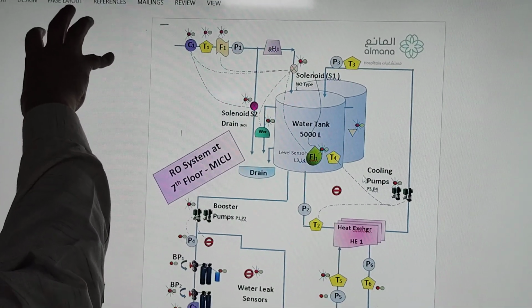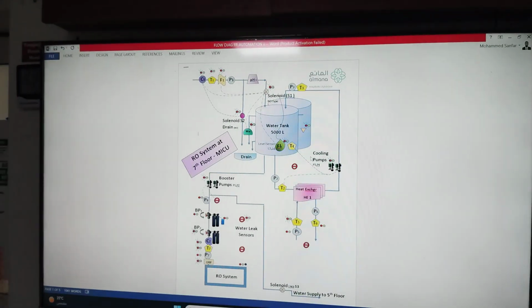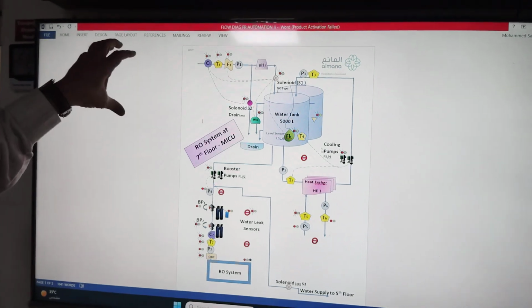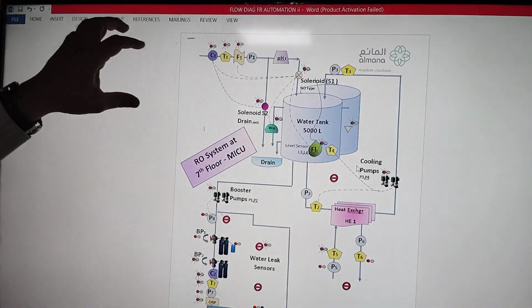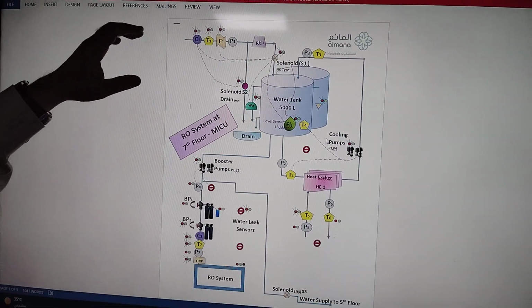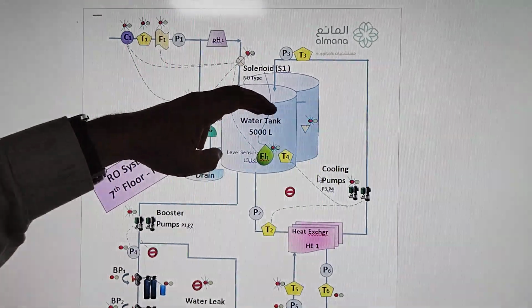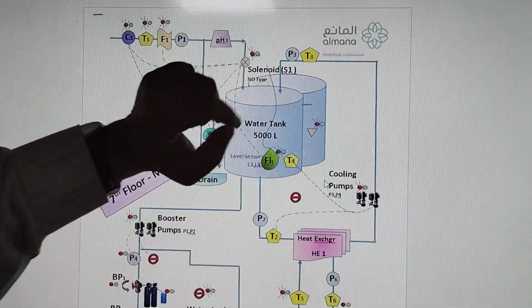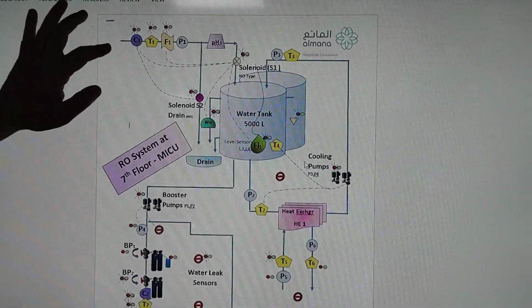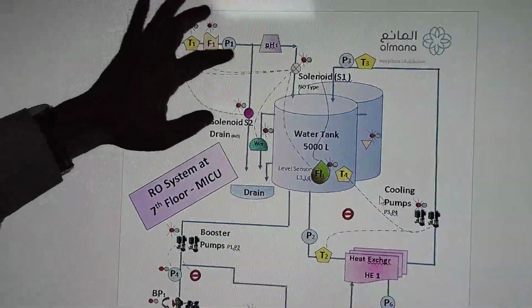They prepare the water to a quality of up to 200 microsiemens maximum, and then it is stored in two tanks, 5,000 liters each. Once it is filled up and ready, it will be fed into our feed water tanks. We have two 2,000 liter tanks over here. Once the water comes in, before it comes into the tank, it has to pass through all these sensors.